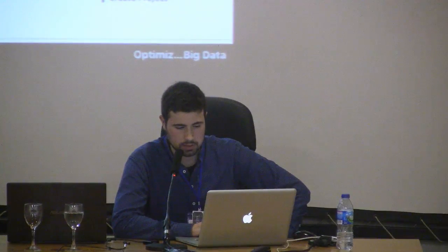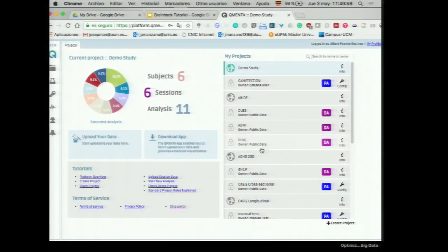What we have here is multiple projects. Projects can be private or public. When they're public, everyone can have access to them. It's like public databases that we gather and put all of them here, so that people don't have to download all these files, but can just refer to here. You can also download files from here, but the intention is to have a unified place for all these databases. Then you can easily see what is in this study, in the sense of analyses that have been performed and the data that is in there.